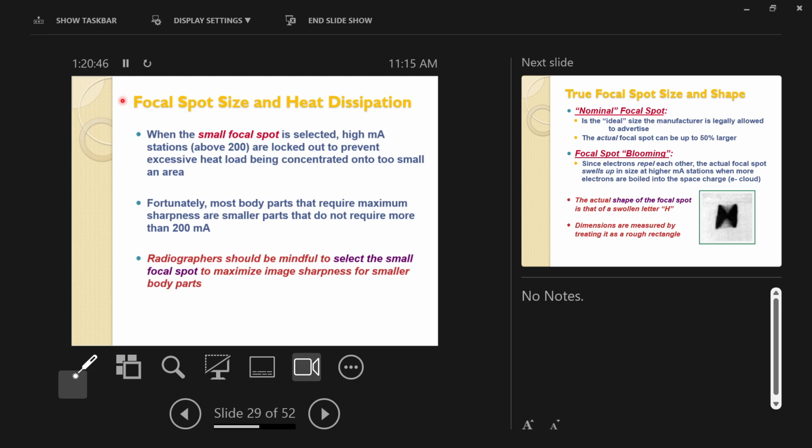That's the gas, right? Well, what form is the tungsten of the anode disc in right now? It's a solid, right? Well, it has a melting point where it will turn into a liquid, 3,400 degrees Celsius. There is an additionally higher point, a higher phase transition when it gets hotter, and it can turn into a gas. Metals can be gases just like any other materials, right? If you heat them up hot enough, they can turn into a gas just like anything else. It's just that you have to heat them up really, really hot to turn them into a gas. Well, you can produce enough heat inside of the equipment to vaporize tungsten, and here's the problem.